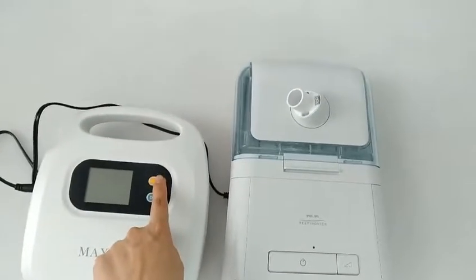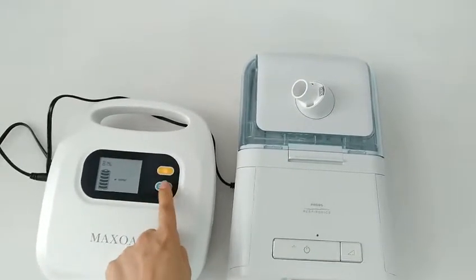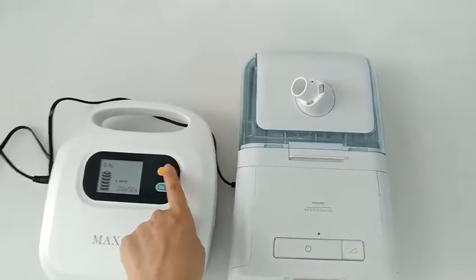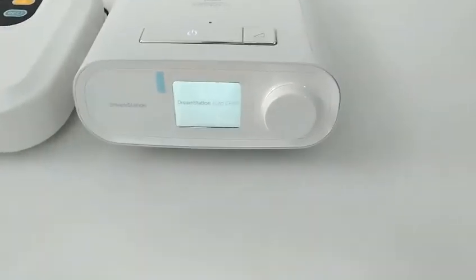Press the power button on K5 for about 3 seconds until the LCD screen turns on. Press the DC button. The output voltage flashes on the screen. Press the power button to confirm the output voltage and start charging the DreamStation.